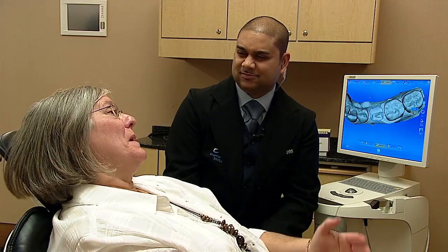Oh, probably. Maybe. I did it in my 30s. We can certainly do ideal dentistry and shift everything to close that space, but her occlusion is dialed in — she's a Class I molar and canine relationship — so it would have been an orthodontic challenge. At this stage, what we're opting to do is place implant number 20 and restore her with the appropriate size tooth that's in full occlusion in maximum intercuspation.